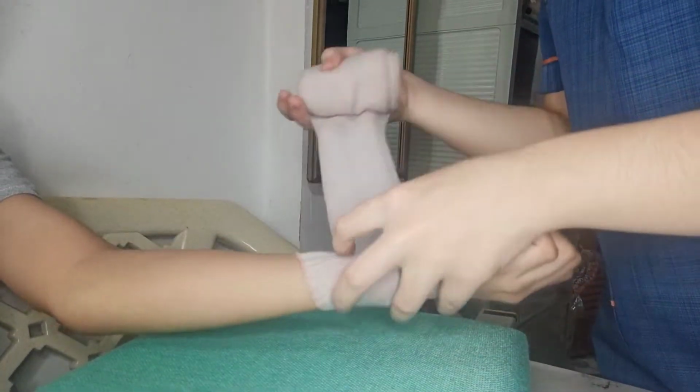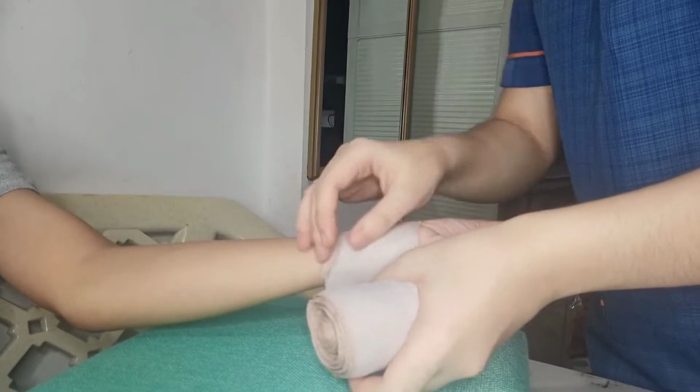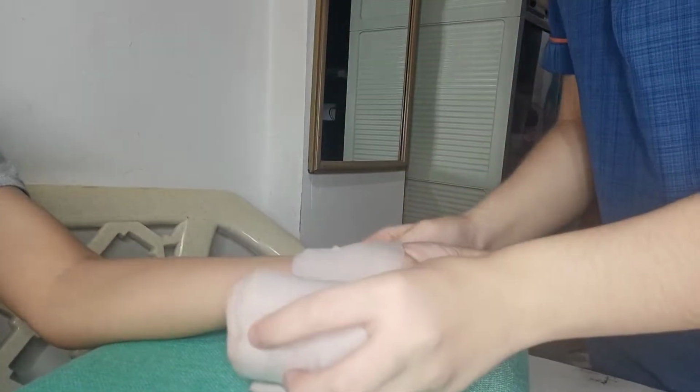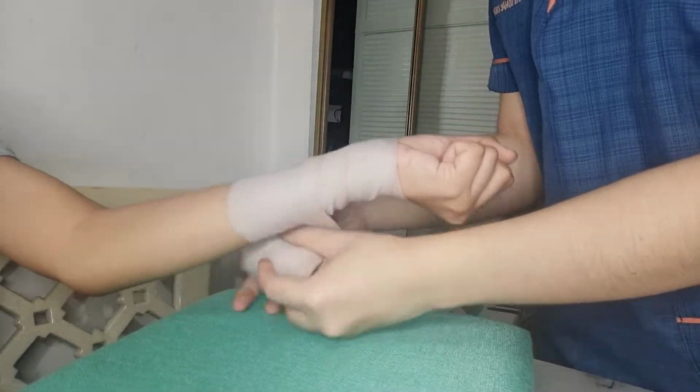Anchor the roller bandage at the wrist. Apply succeeding spiral turns up the forearm, with each turn overlapping one third of the preceding turn. Then terminate and secure just below the elbow.